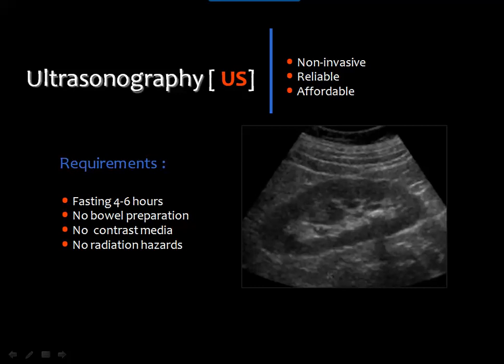Ultrasound is an old and recent imaging modality. It has a major role in evaluation of the urinary system over many years. And ultrasound is a non-invasive tool. It is reliable, it is relatively of low cost, does not use ionizing radiation, and can go to the patient bed. And then if you want to examine the patient with ultrasound, there may be some need to fast to remove some of the unnecessary gases in the abdomen.